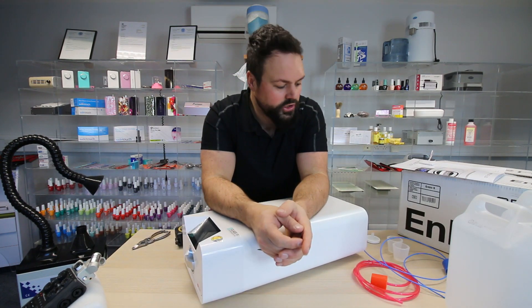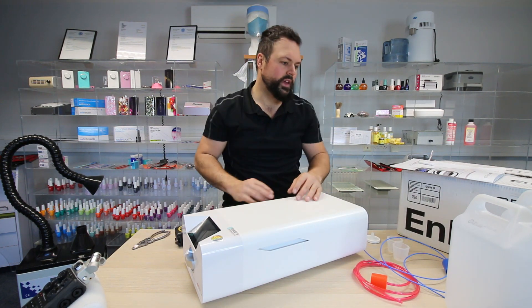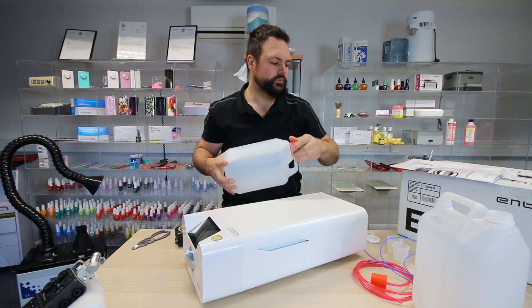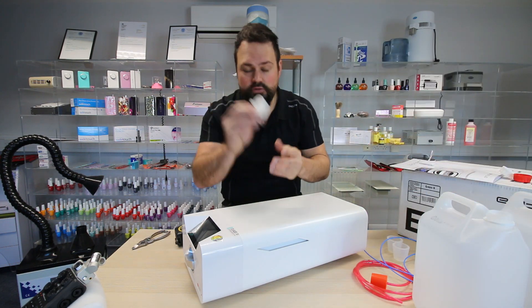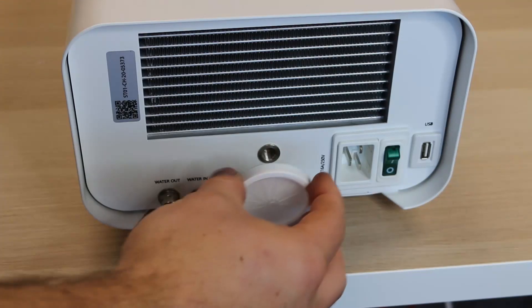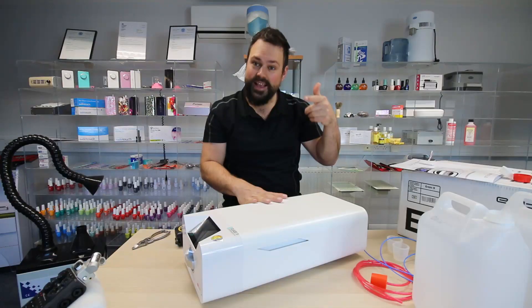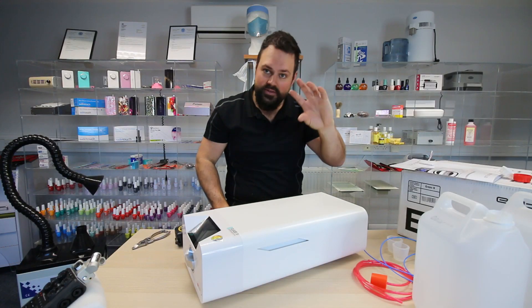For the initial setup: you get your autoclave out of the box, get it all on your desk. You get your two jerry cans ready, take your lids off because you don't need the lids — the bung goes straight in the top. The first thing you do is put your HEPA filter in — it's a dead easy job. There's a thread on the end and you simply screw it in. Don't over-tighten it — it's a plastic thread, so just go very, very easy and let the thread take its own course.